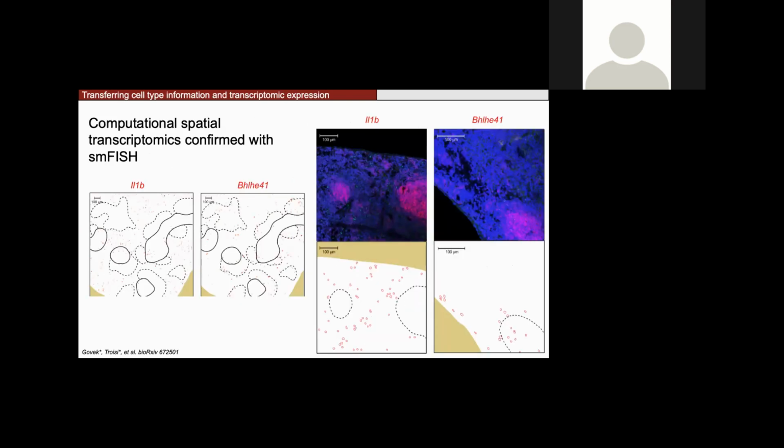The reason that we just decided to go with one is we're only using it for plotting. We're not using it for too many further downstream analyses or statistics. So the different ways of computing the gene expression don't significantly change the visualization.